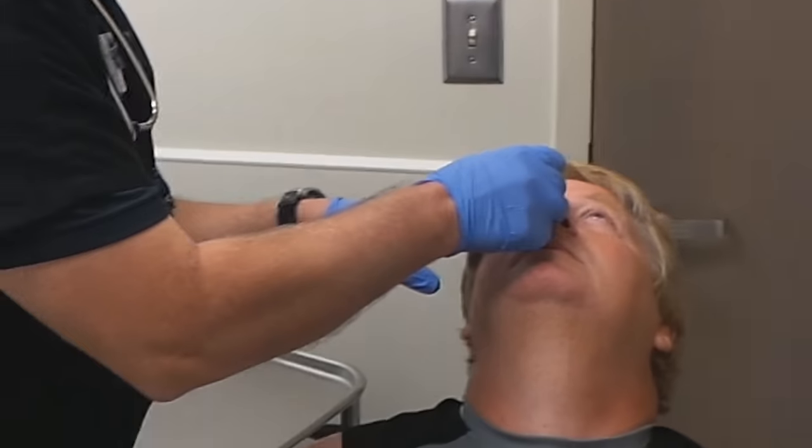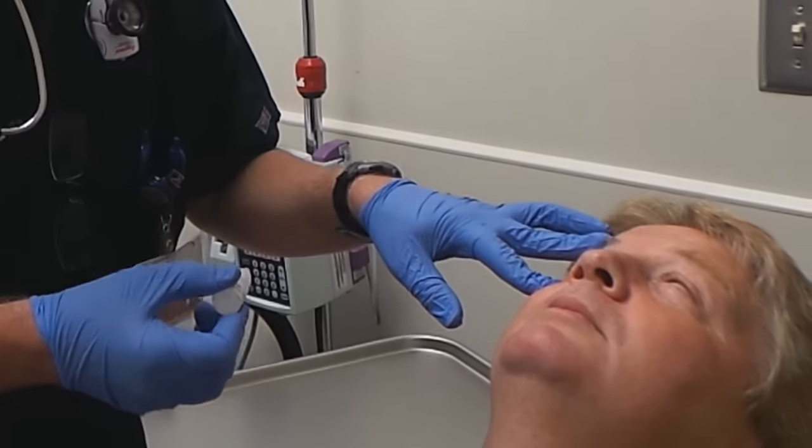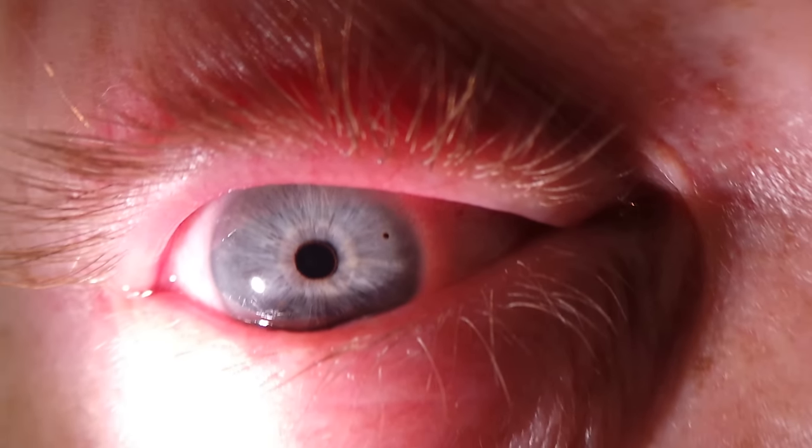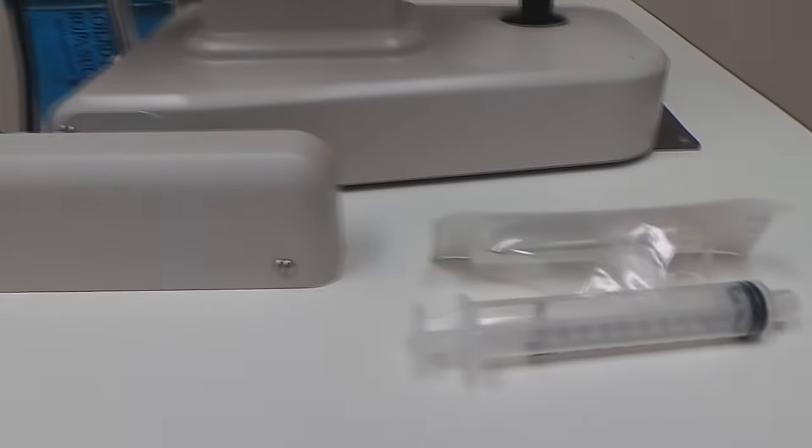Let me numb your eye up here. I'm going to put a drop or two of tetracaine in the eye — that'll numb it up and let us manipulate the eye and do what we need to do. I am going to get an x-ray because sometimes a high-speed piece of metal will actually penetrate into the globe itself. If we get up real close, you'll see a little speck about three o'clock in that eye. We're going to use a slit lamp and scrape it off with an 18-gauge needle.